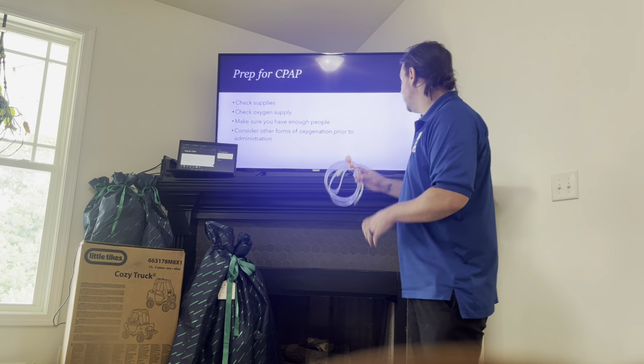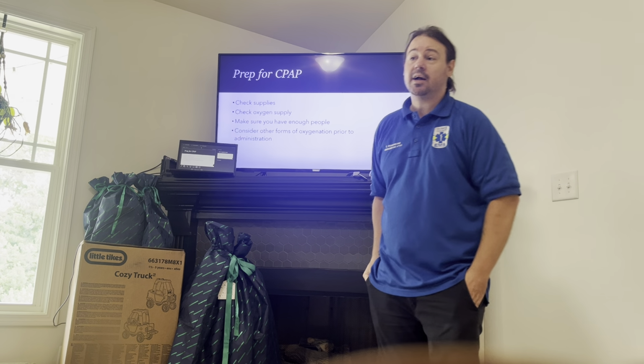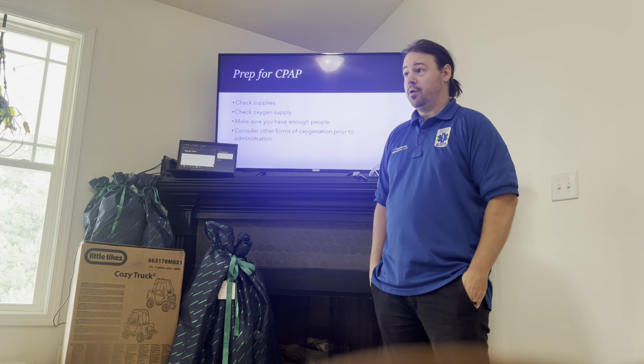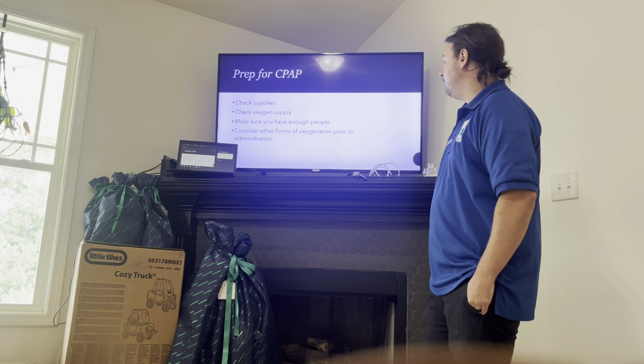There's no issues there. We want to check our oxygen supply, right? Because we want to make sure that we have plenty of oxygen. CPAP does take quite a bit of oxygen, and so we want to make sure that we have a good amount of oxygen in our tank before we go ahead and set up and apply CPAP.